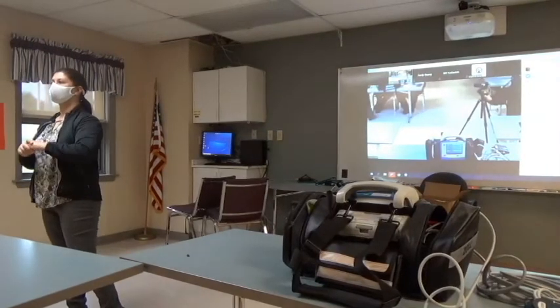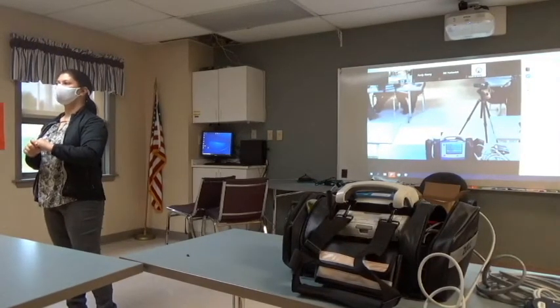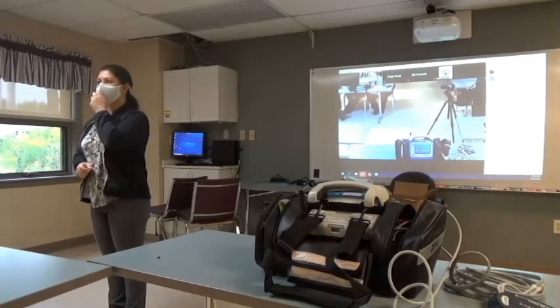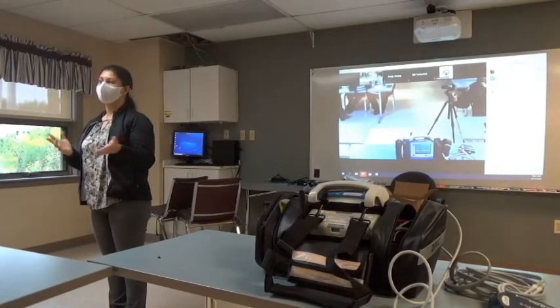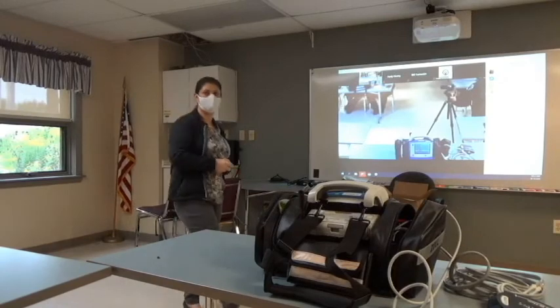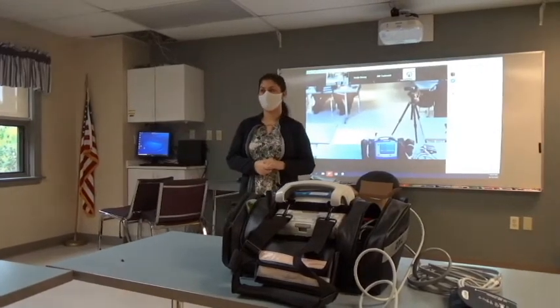It should not default to in sync. It should default to out of sync. Because if the patient converts to a pulseless rhythm, it's going to be looking to sync on something it can't sync with. I agree. So you should manually have to sync. Okay, so we're going to leave it that way? Yes. Got it. That's just one soft piece, so it's not like it's a big step.